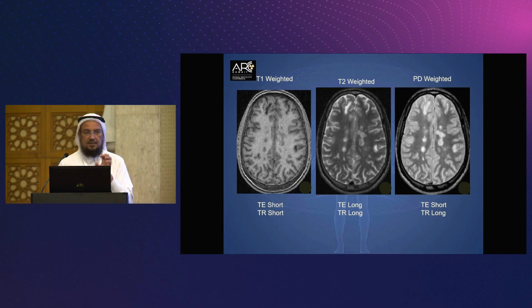This is the T2 weighted image. It reflects how fast the protons are dephasing. The bright signals keep intact for a longer time. So after excitation, they're still holding even after more time, sometimes even after 100 milliseconds, 200 milliseconds, you still see them. While the dark ones dephase immediately after the excitation, so they will appear dark.